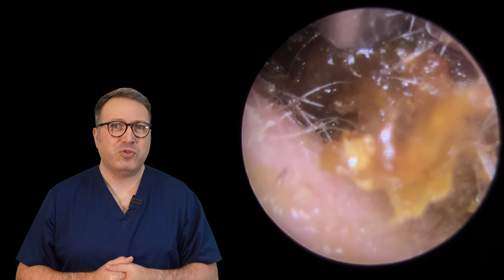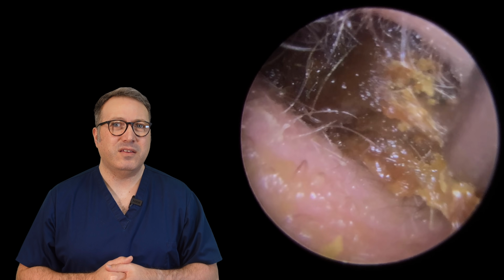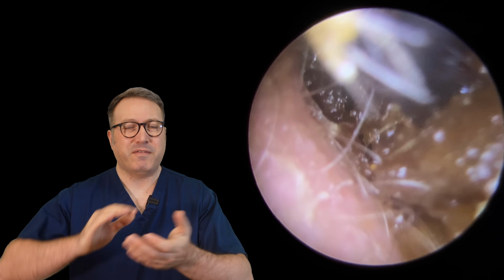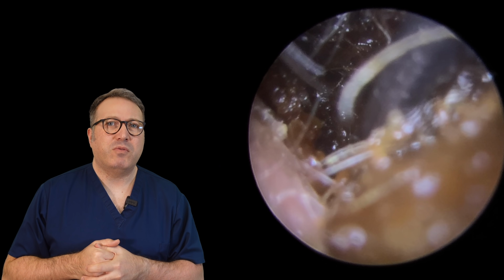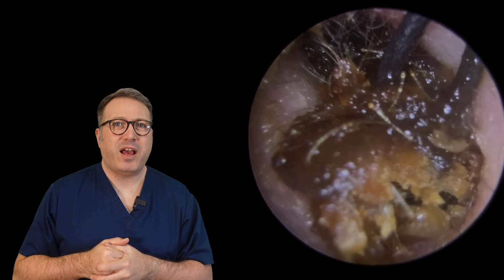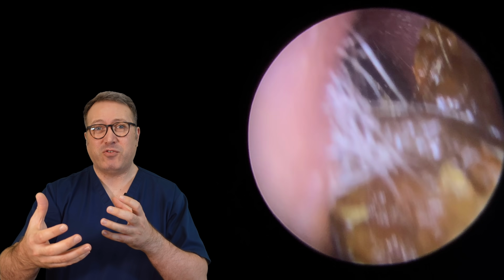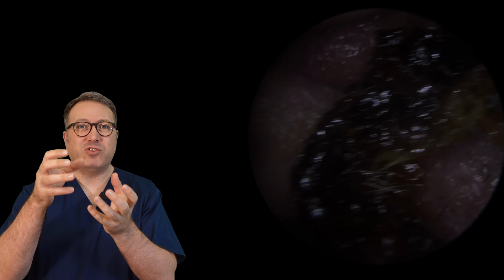Is this going to budge all the way out? You can see we've got a good grip where it's not. Jobson horn coming in here just to give us almost like a fulcrum, to be able to lever this out, which is what we've got. There we are, we've got that front section, but as we pull, it's really connected to the rear section as well. So if I'm lucky, we get a grip there, the whole thing is going to come out, which is exactly what happened. So you can see this really dark material, this really dark wax.